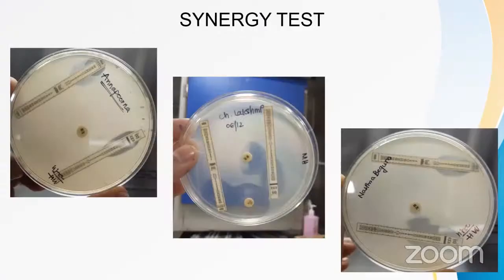So these are the synergy tests using E-strips. You can see the first one is not showing synergy at all. The middle one is showing synergy, and the last one is showing partial synergy.